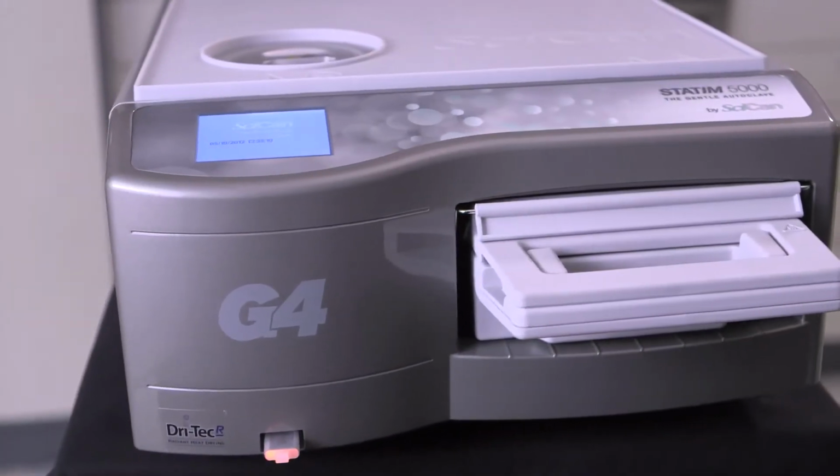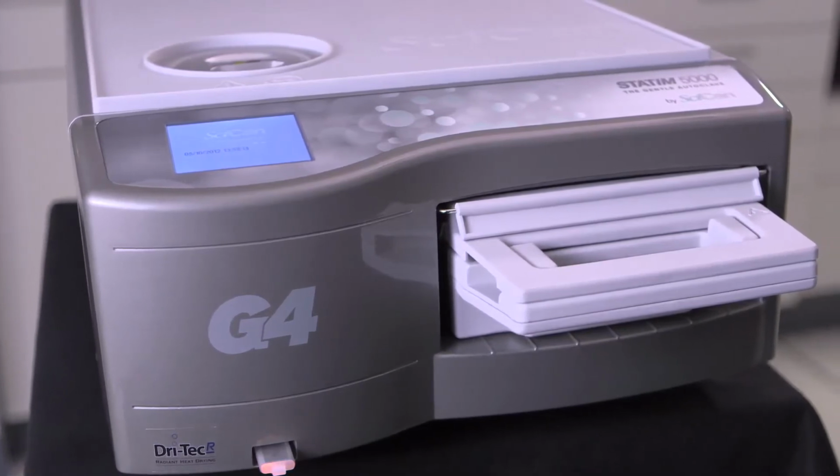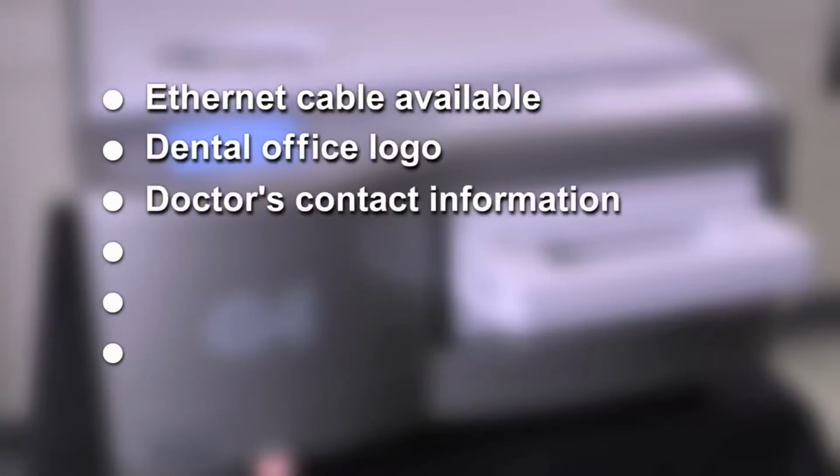Before we dive into the features of the G4 technology and how all the options work, we need to get a few things set up. Ensure that there is an Ethernet, Cat5 or 6 cable available in the sterilization area. Dental office logo. Doctor's contact information including email address.